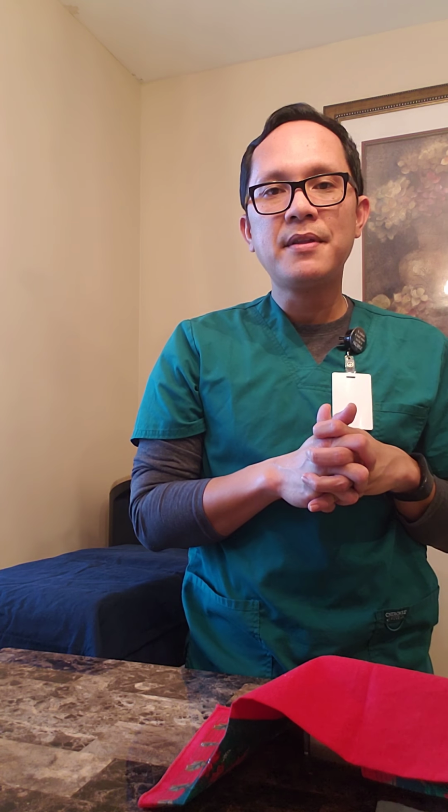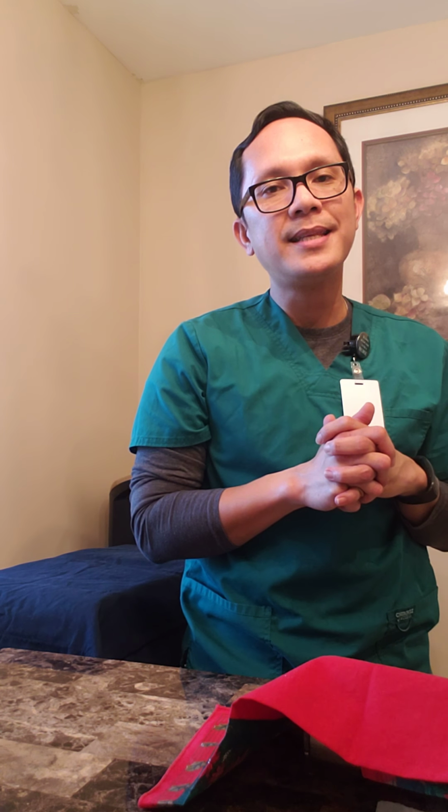When I go to her room, of course I'm going to introduce myself, do some hand hygiene, and make sure I check the doctor's order. I also double check my patient with at least two types of identification, checking her wristband and making sure everything is correct. I have the correct patient and the correct order, and the order also has the type of Foley that we're going to be putting on her, and the size of the Foley as well.